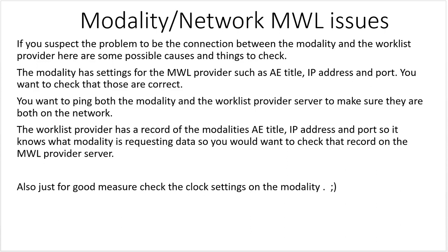Also, just for good measure, check the clock settings on the modality, and that will be really important at 2 times in the year. And those are when we set the clocks forward and when we set the clocks back. The modalities don't always update correctly, and consequently they can be an hour off, and that will affect your modality worklist.